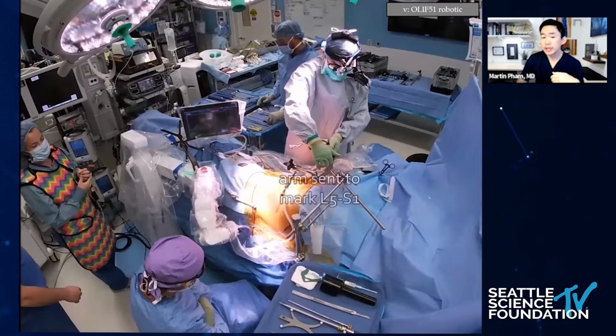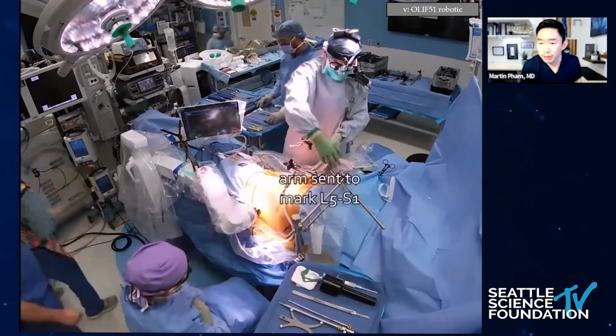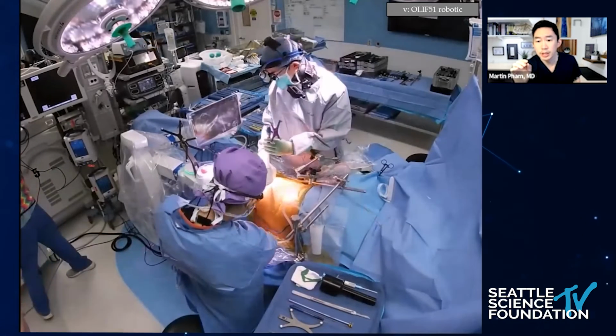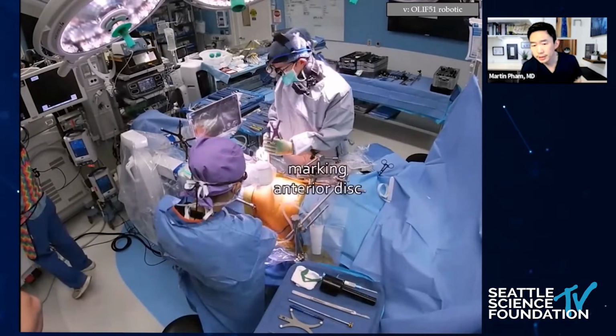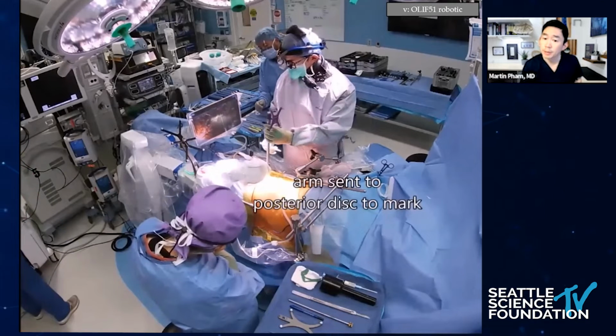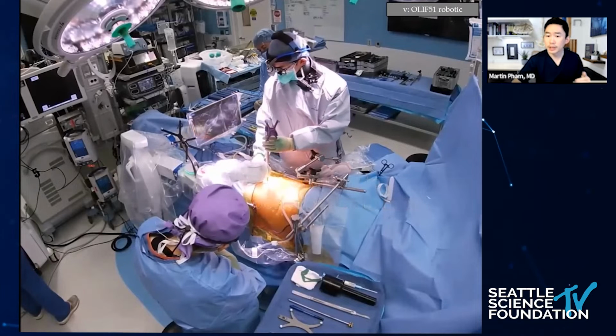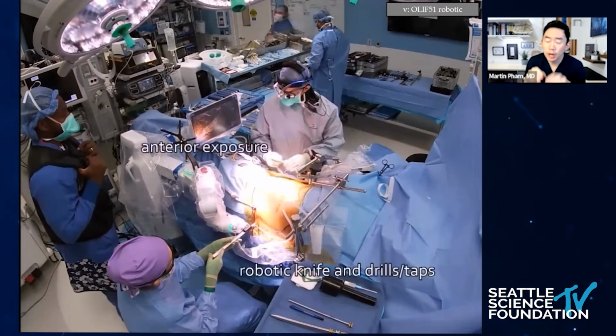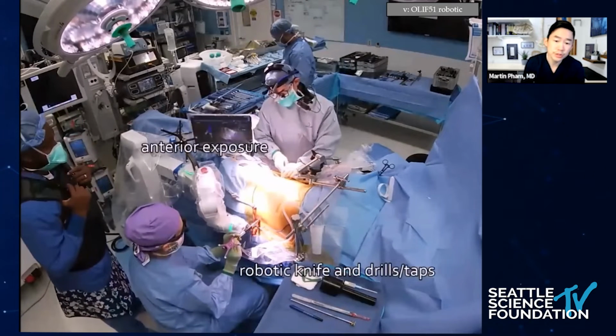And here you can again see once the robot is registered, I'm sending the arm to the disc space. Specifically, I'm sending it to the anterior disc, and then I mark that, and I send it to the posterior disc, and then I mark that. So now I have my sacral slope. The arm is then sent back to the posterior surgeon. While my assistant is putting in those 4 screws, I can expose anteriorly to the 5-1 disc.